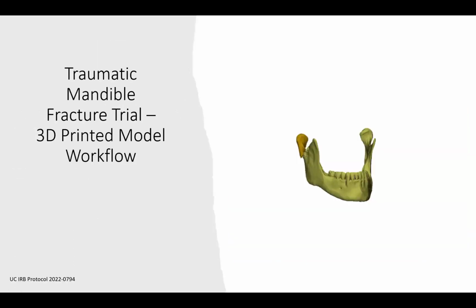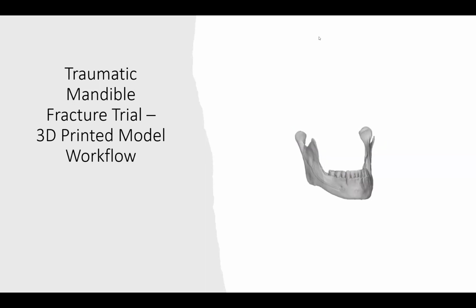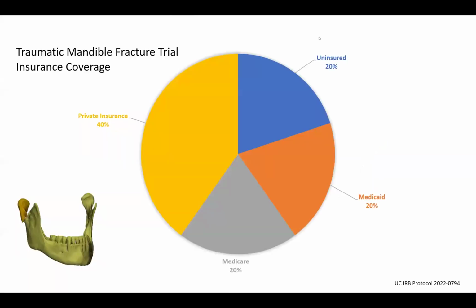in UCMC. Just a quick review of what we're doing here for those who may not be completely familiar. We'll start out by segmenting the fractured mandible, modeling it in CAD, reducing that fracture digitally, perfecting that mandible. So now we have the mandible fragments back in proper location, giving the patient the best occlusion. And from that, we'll 3D print a final model.